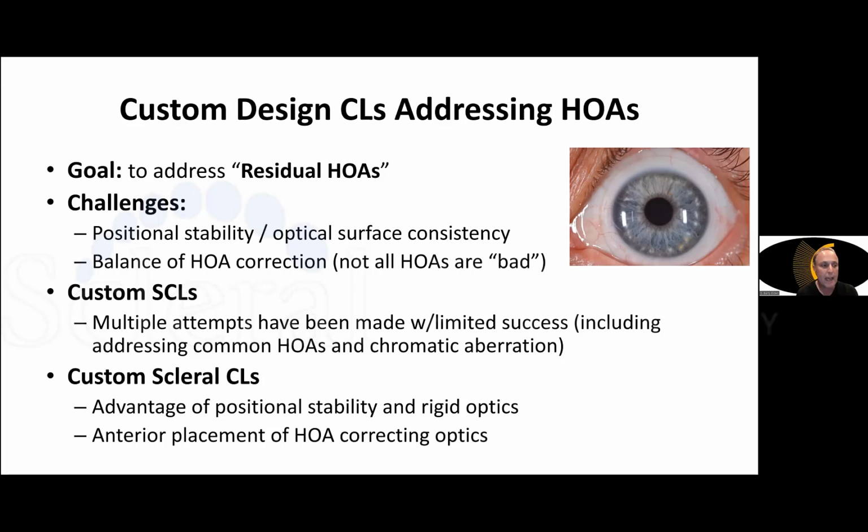Of course, surgery: we know that corneal shaping anomaly correction, whether it's therapeutic PRK, a PTK, things like that, we can do topography guided ablations, and John could allude to that a little bit in a few moments, all addressing some of these aberrations that are induced by the shape of the cornea. And then we can consider that also in IOL calculations. What type of IOL? Maybe we want to use an aspheric lens if we have certain forms of spherical aberration in terms of their values and such.